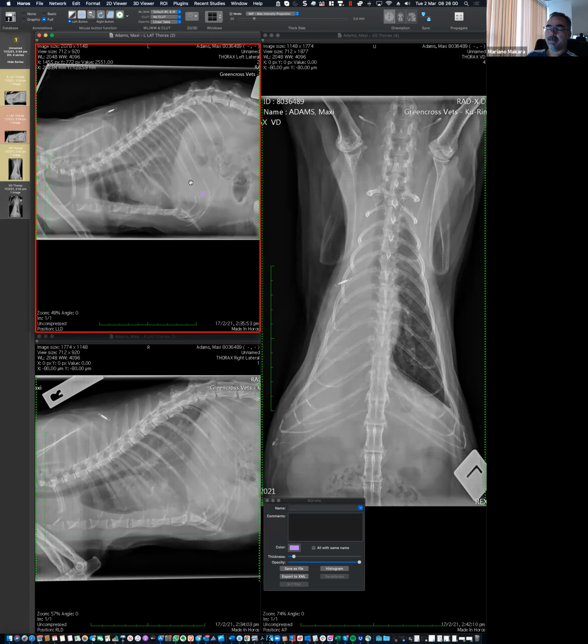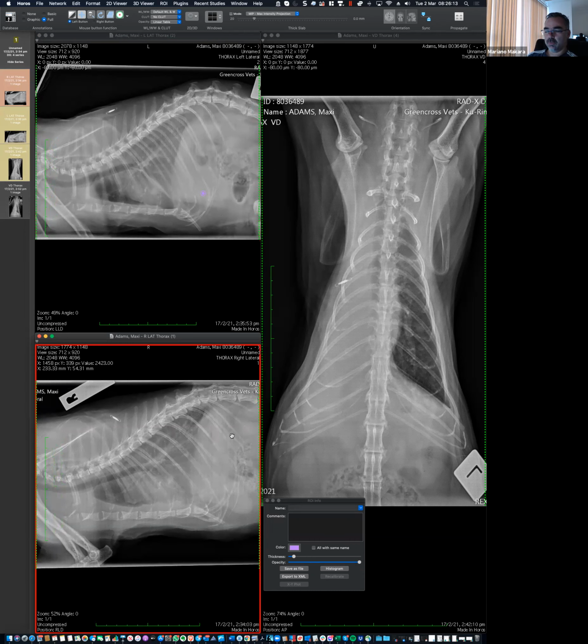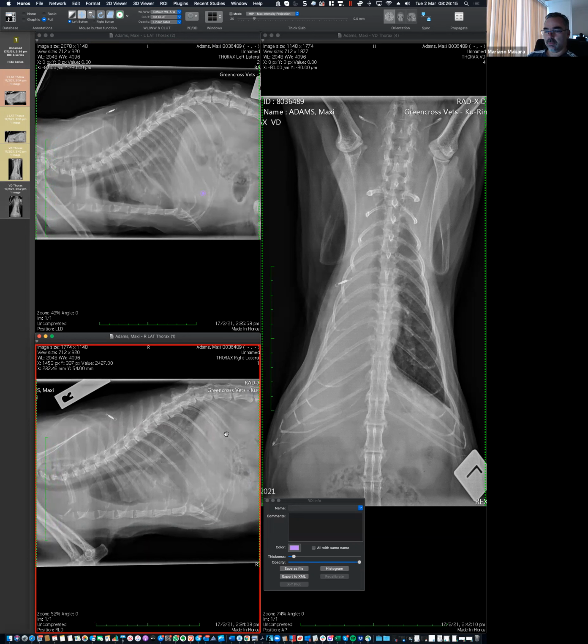But you open kind of a nice door, and I think it's worth discussing. Where are these severe changes in the other projections? Yeah, I can't see them at all.